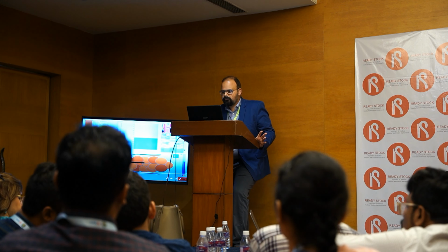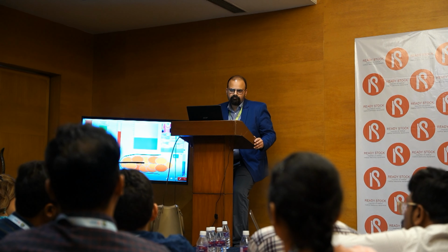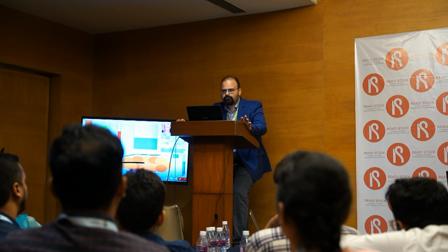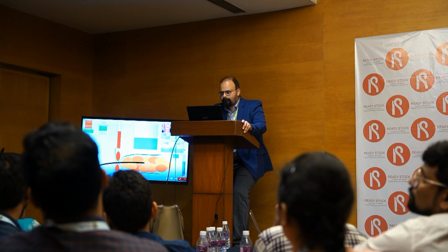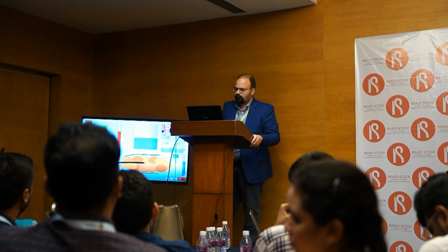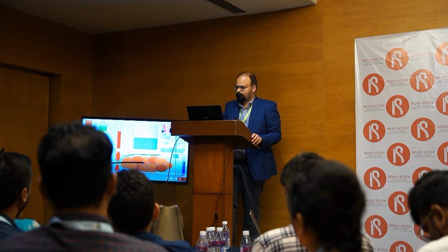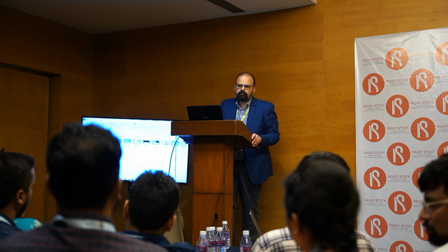So it's a bit of a boring job. It's a time intensive job. You need to have time out of your interventional endoscopy to spend on this. So any questions on biofeedback? This is just what to explain to the patient, what we are doing. Any doubts or anything?